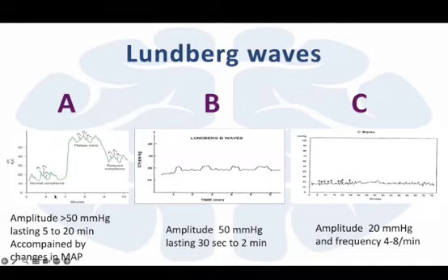And when you see a wave like this, it means that the patient is losing the autoregulatory capacity and is losing the compliance, because what generally happens is that maybe the patient has an episode of reduced arterial blood pressure.